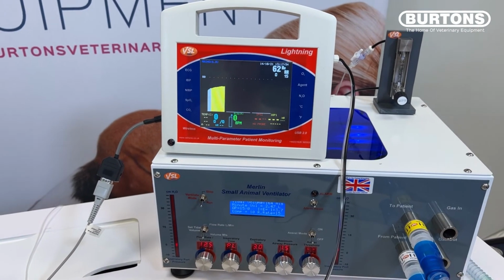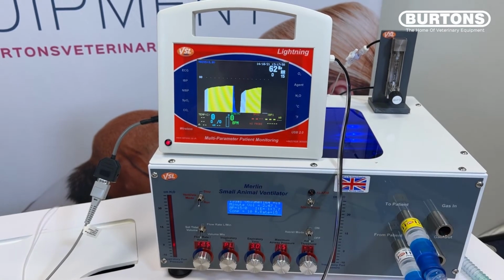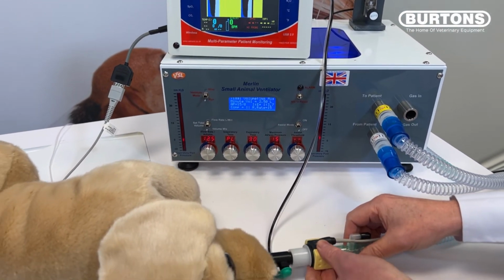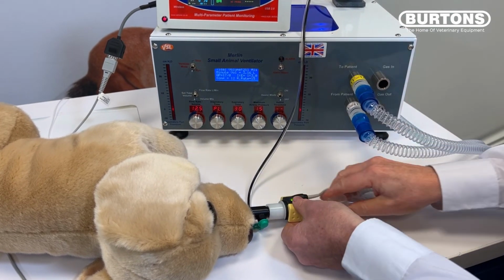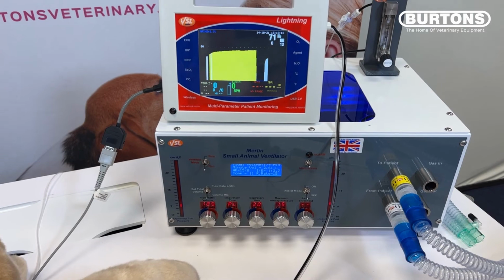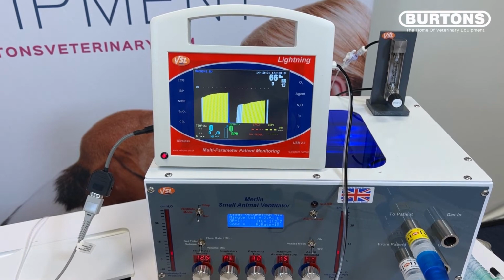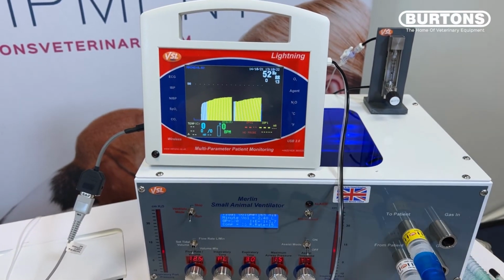And as I say, you can see the degree of rebreathing is the extent of blue. You shouldn't really be seeing any blue in the color-coded trace. I'm going to remove the dead space again, and we'll see the blue will then disappear. So having removed the extra dead space, we should see a reduction in the end tidal CO2. And now we're back to having a very tiny slither of blue, which we should see in the normal trace.